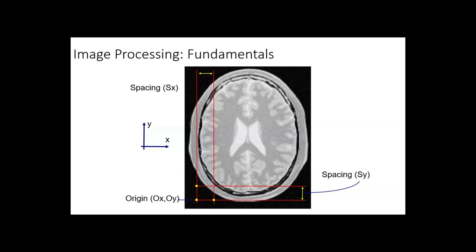But in medical image, we use the real world coordinate system for the brain. So basically it's 256 millimeter by 256 millimeter by 256 millimeter. If your image resolution is exactly 1 millimeter, then your image size is 256 by 256 by 256. But if you're using a better machine, let's say your resolution is 0.5, I don't think we have this high resolution, then you double the image size, right? This is just a convention in the medical field.